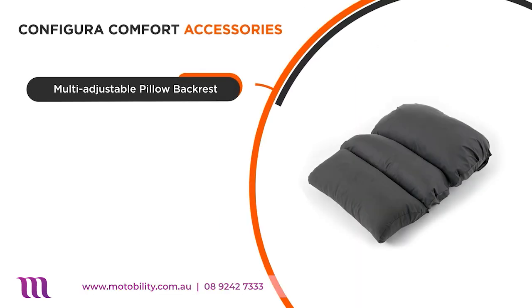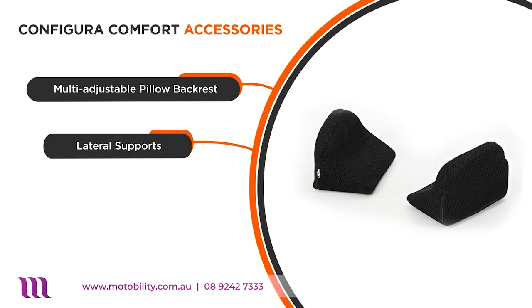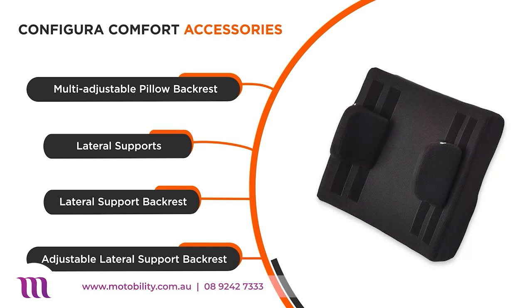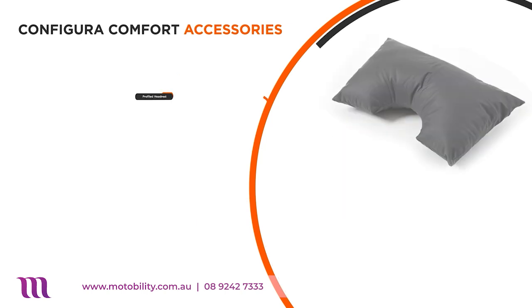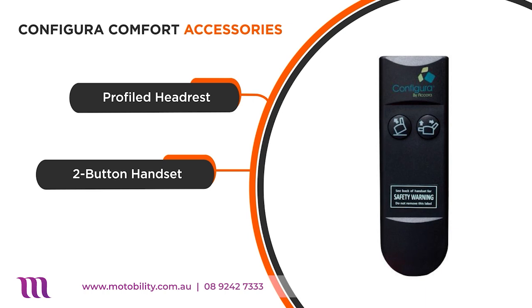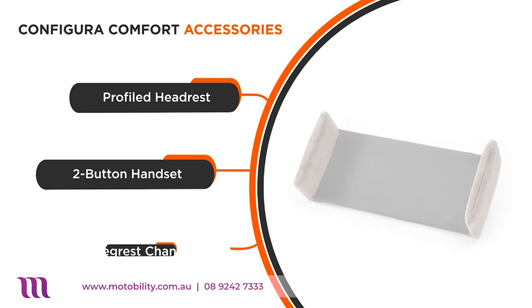Other accessories available are pillow backrests that you can adjust to your needs, lateral supports for added comfort, lateral support backrests, and adjustable lateral support backrests. Also available are profiled headrests, a two-button handset to easily operate the Configura Comfort chair, and a legrest channel for total leg support.